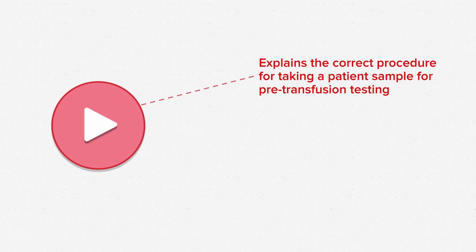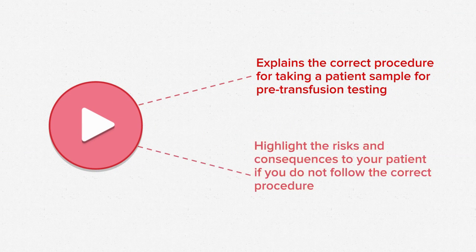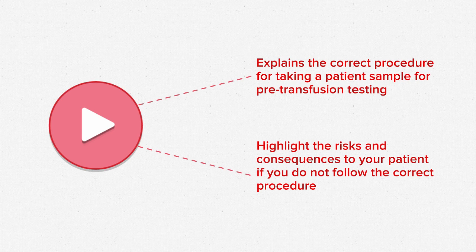This short video explains the correct procedure for taking a patient sample for pre-transfusion testing and seeks to highlight the risks and consequences to your patient if you do not follow the correct procedure.